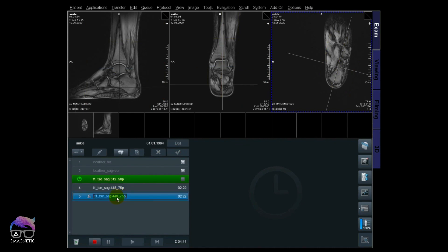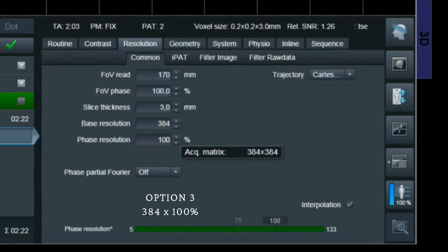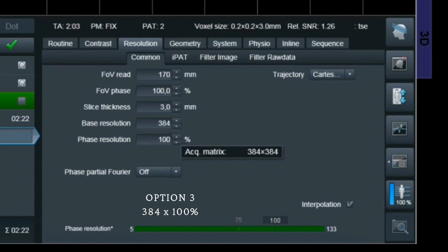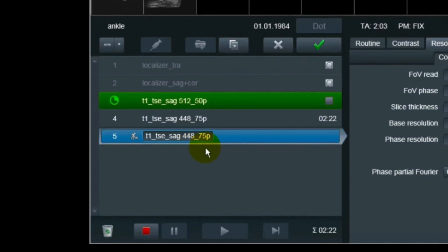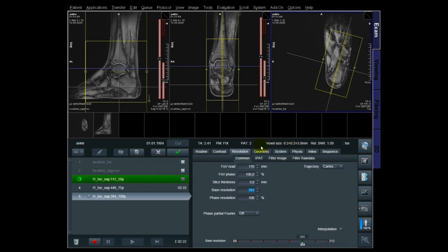For the third sequence, let's change to 384 base resolution at 100% phase resolution. This means acquiring a matrix of 384 phase encodings and 384 frequency encodings — a square matrix. Checking the voxel size: we're acquiring 0.44 × 0.44mm — square voxels — which interpolates down to 0.22 × 0.22mm, exactly half in both directions. So compared to the 512 option, the voxel size here is actually bigger, but it is square. Let's apply and scan that one.